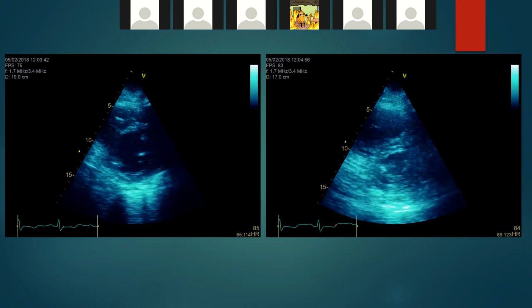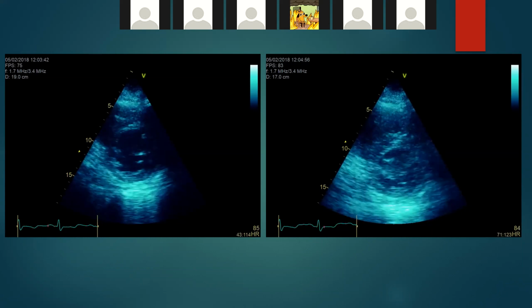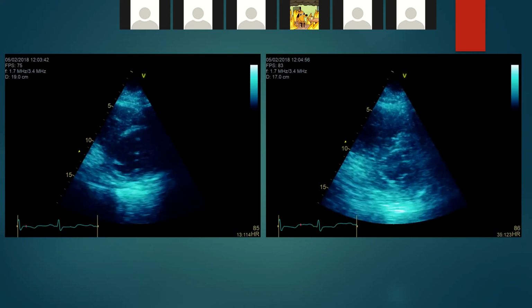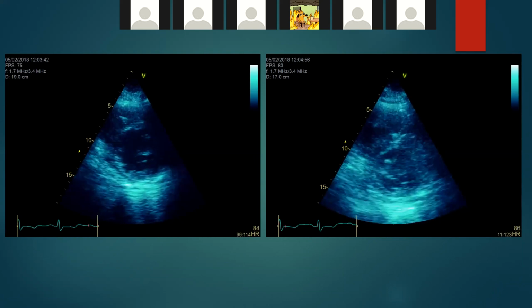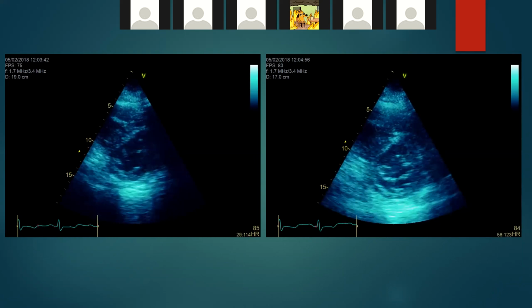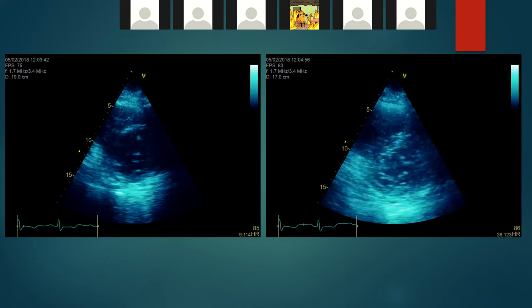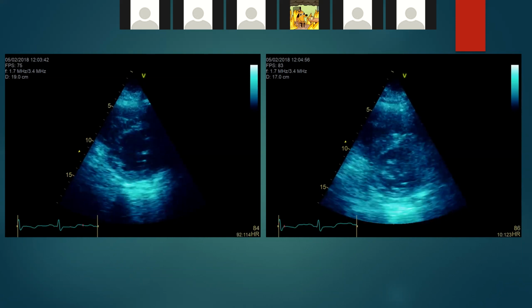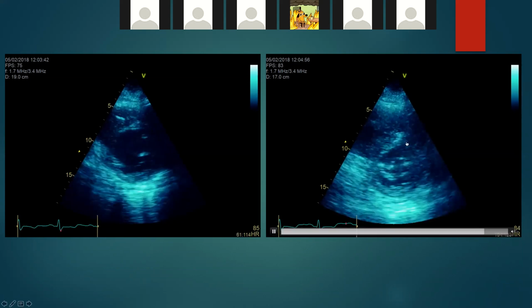And on the right-hand screen, I've got more of a fish mouth appearance, which is going straight for the orifice of the mitral valve. I'm just trying to see, I'm not seeing anything else at 10 or 11 o'clock on the right, but the left is concerning for that echo density, which is overly mobile.